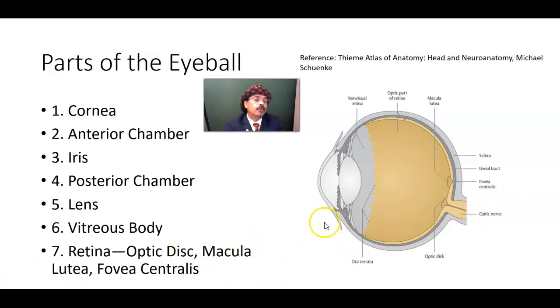Look at that. The optic disc is a flat area with a little bit of depression here. This is the optic cup area. Okay, this is not protruded inside. If it is protruded inside, then its margin will be obscure. We call it papilloedema. That is associated with increased intracranial pressure.